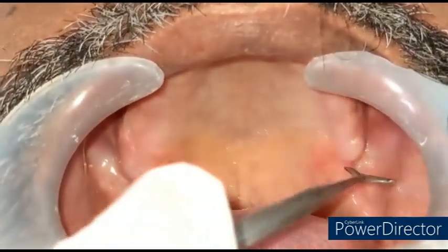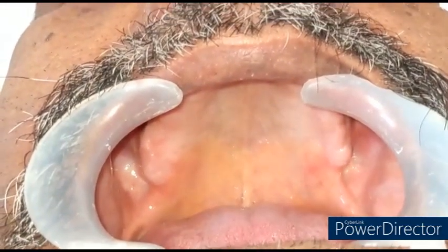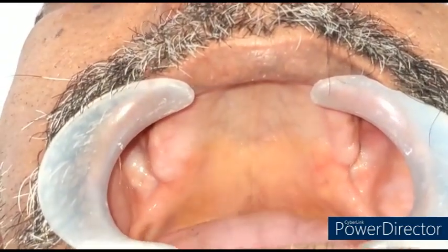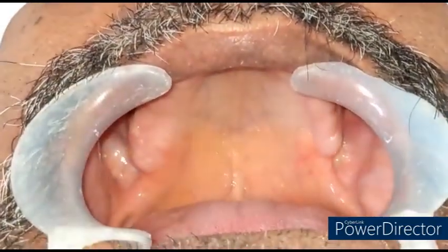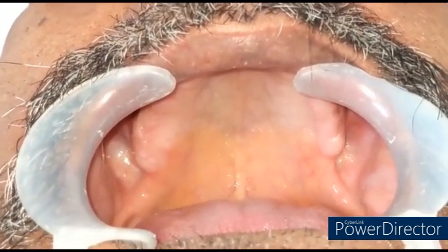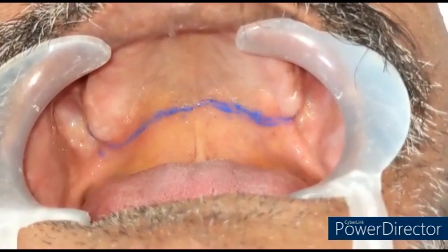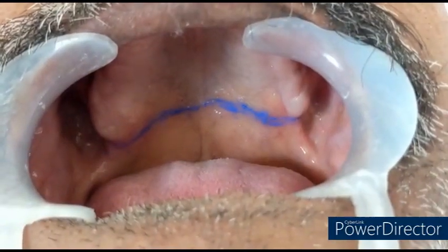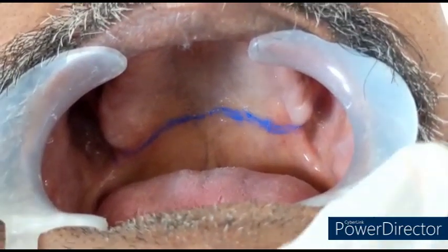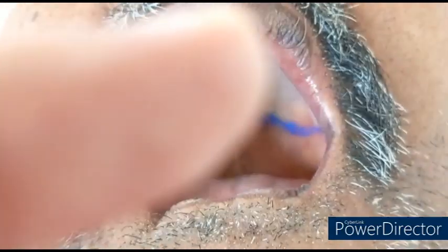Then you have to join this side to this side, and ask the patient to say "ha" in a short vigorous burst. Ha. Ha. Ha. So you can see the depression or the demarcation between the hard and the soft palate. That area you have to mark with the indelible pencil. Now I have marked the extent of PPS with the procedure which has been already mentioned. After marking with an indelible pencil, I am removing the cheek retractor and inserting the upper denture.